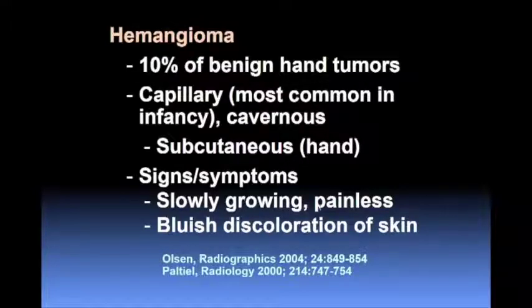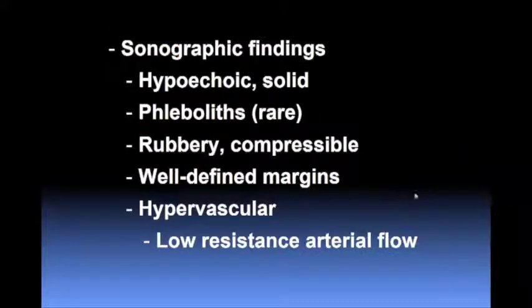And I've seen that a few times, which has helped me with the diagnosis. So again, looking at the location, turn on the lights in the room and feel it, move it around, can really be helpful. These two are hypoechoic and solid.